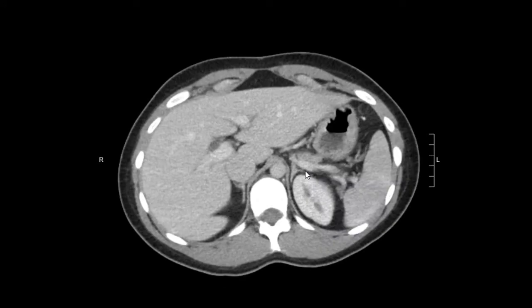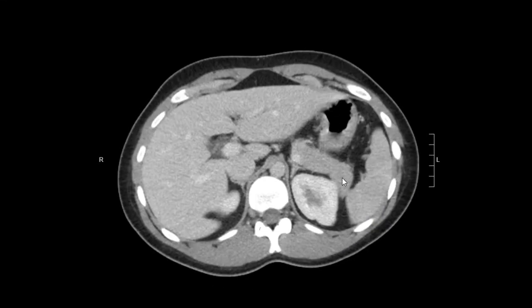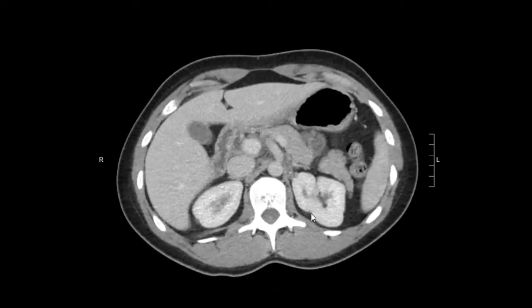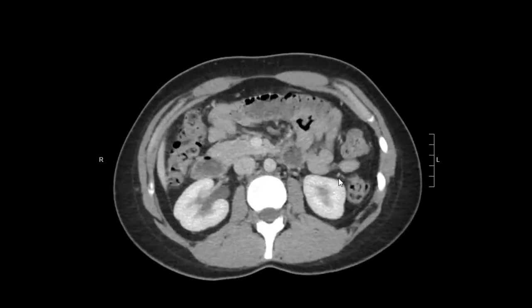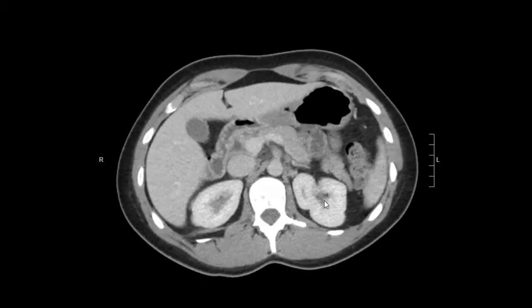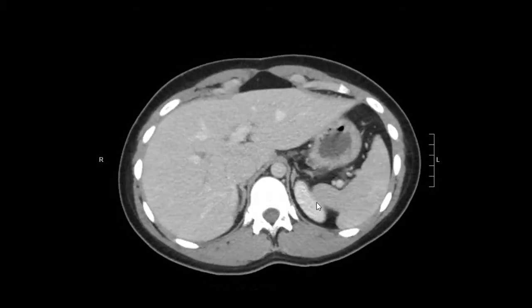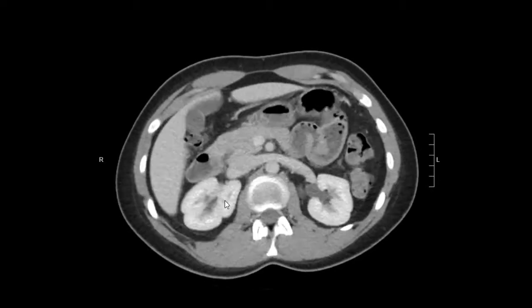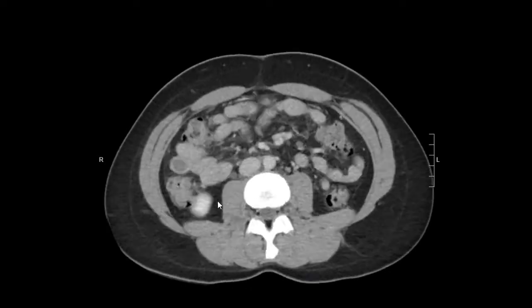Then we're going to look at the genitourinary system, starting with the kidneys. So the left kidney here — no focal mass, no dilation of the collecting system. On the right, it's the same thing, pretty normal.